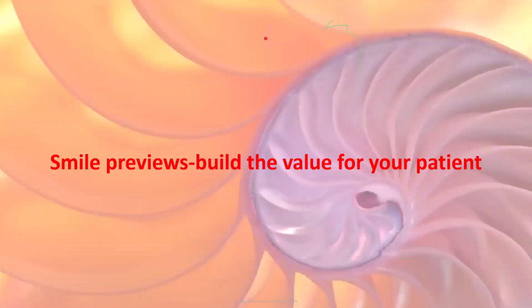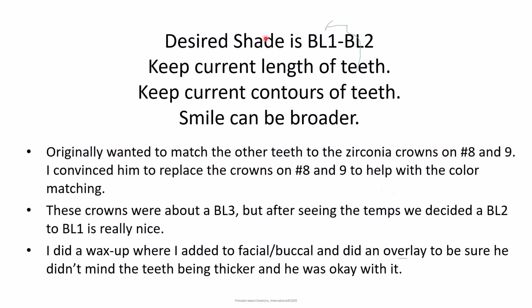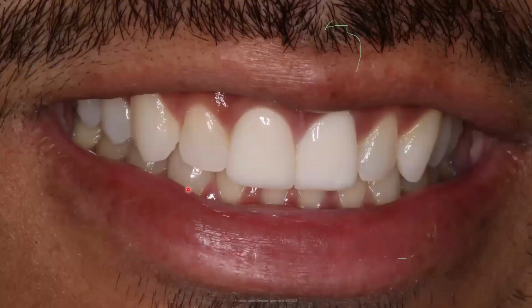What does that mean? Before we get the patient into that live patient prep session, I call the patient back in the office. The patient in this case had crowns on 8 and 9. So I told the patient, come on back in and we'll just do an acrylic overlay over your teeth. And if you look, his teeth aren't that bad. These are crowns 8 and 9.